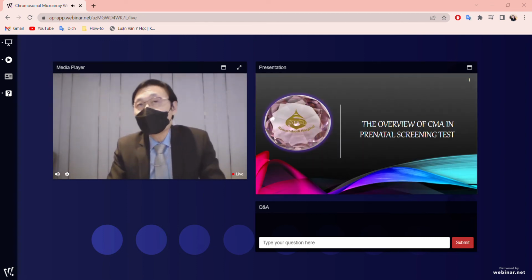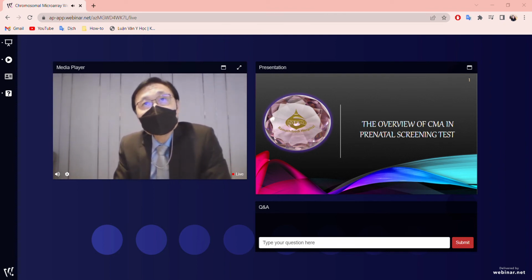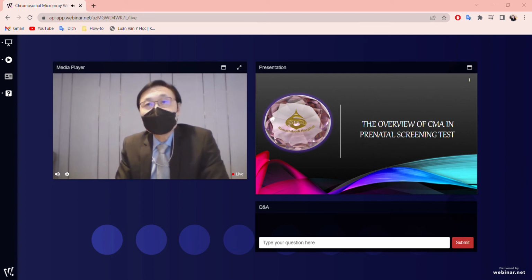Right. Thank you very much for the nice introduction. Ladies and gentlemen, it's my great pleasure and privilege to join this conference on the overview of CMA in prenatal screening tests. As we know, G-banded chromosome analysis has been the standard method for detection of chromosomal abnormalities for years, and this method has several limitations, including the necessity of performing cell culture, long turnaround times, as well as low resolution to detect chromosomal abnormalities smaller than 5 to 10 megabases.